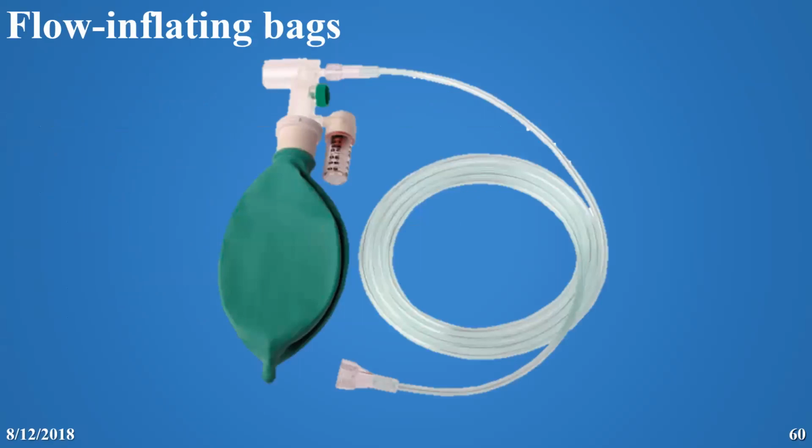Yes, so you connect the flow inflating bag. How do we connect? You connect this to the oxygen source. How do we connect to the patient? There's a mask here. You put a mask, and then through the mask you connect. This should be inflated. Okay, so you'll give 100% oxygen even without bagging.